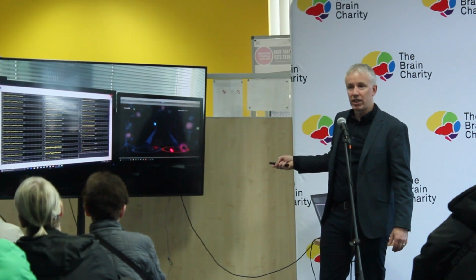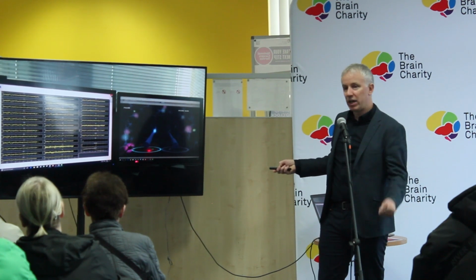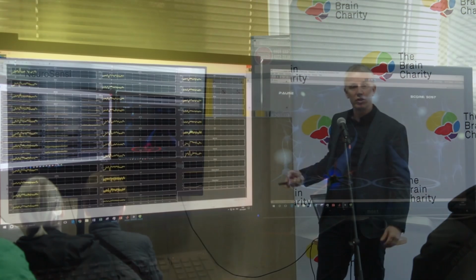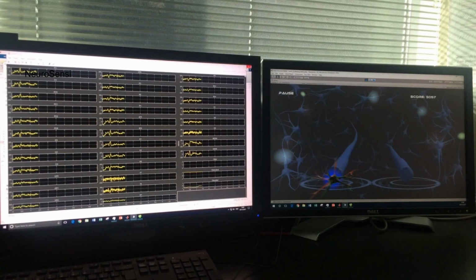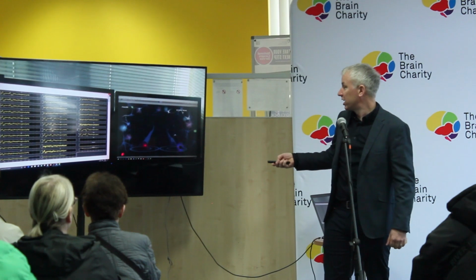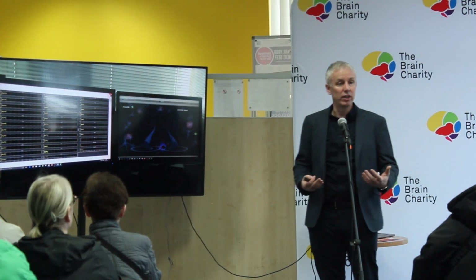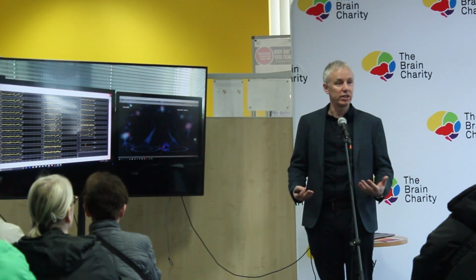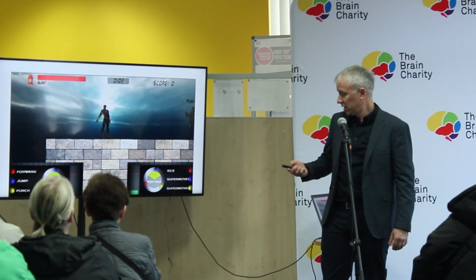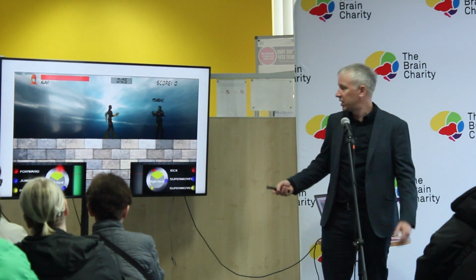That's connected to this character. Whenever the person imagines left arm movement, they move the character to the left, and right arm movement, they move it to the right. And they have to collect these little lights coming up, and they get points for doing that. So the game actually motivates the person to do it. If I put yes here and no here, essentially I could answer questions just by imagining the movement with the brain-computer interface.